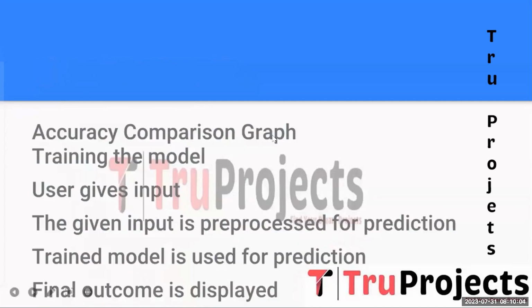And the next one is the accuracy comparison graph. The performance of each model is evaluated based on its classification accuracy. The accuracy comparison graph visually represents the effectiveness of different models. And the next step is training the model. Once the optimal model is identified, it is trained on the pre-processed dataset. During the training process, the model learns from the input images and their corresponding labels, adjusting its parameters to make accurate predictions.